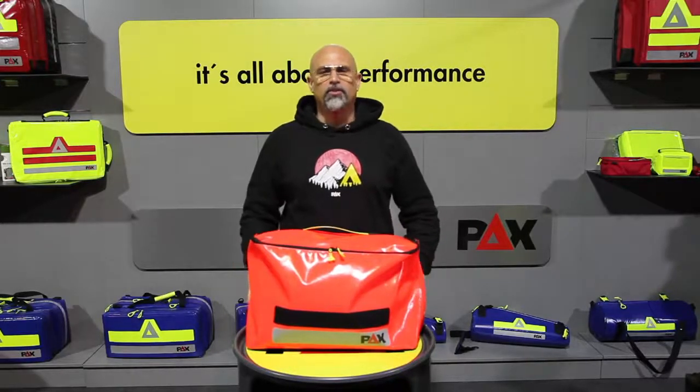Hello and Moin from Wadenburg. Today I'm presenting our PAX infection protection bag, an important helper in infectious environments.